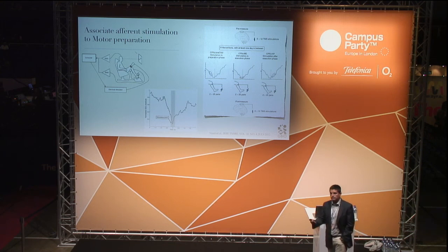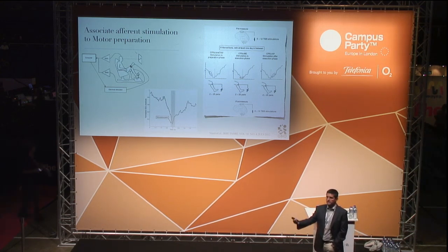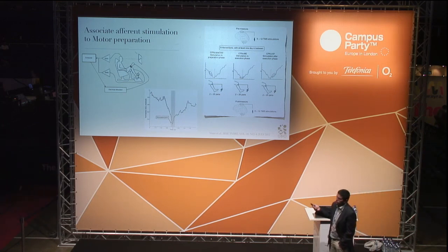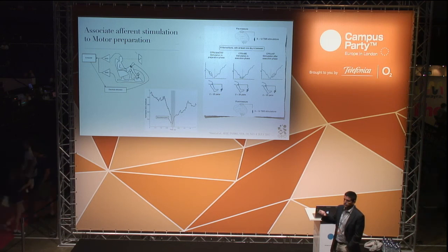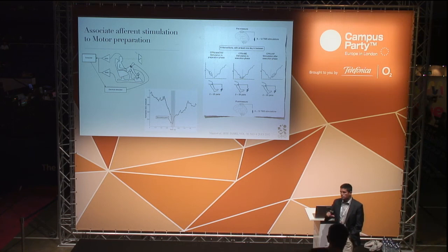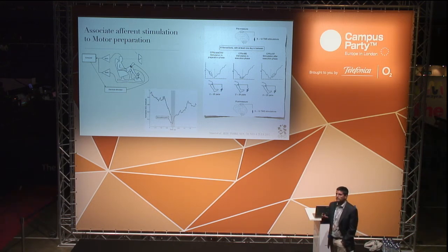And as a consequence of this, there is no feedback. There is no sensation coming back to the brain. So what we want to do with these technologies is to identify with, for instance, BCI technologies, EEG technologies, the intention of the user. For instance, moving this ankle here, and then we use a functional electrical stimulation or the exoskeleton that I was referring to before to move the ankle that cannot be moved by the patient. So in this way, we train the movement, and we also provide feedback to the patient. And the idea is that this, if it is repeated, will lead to a retraining of the motion.